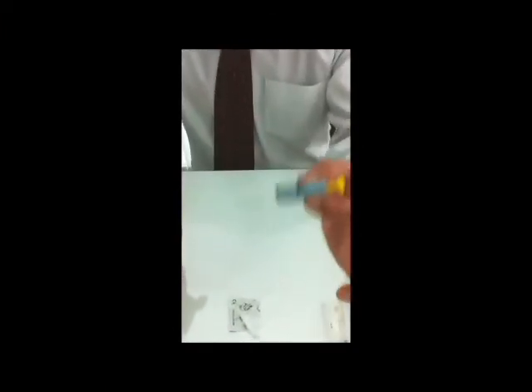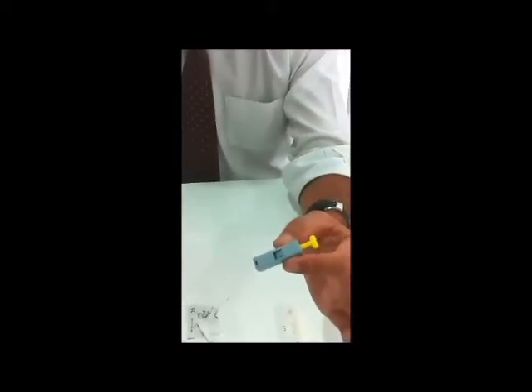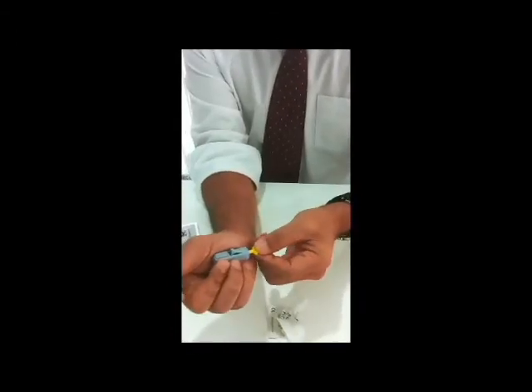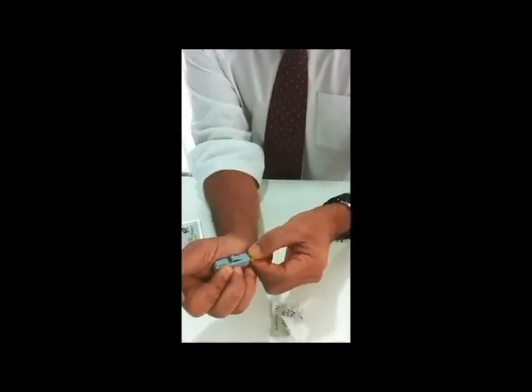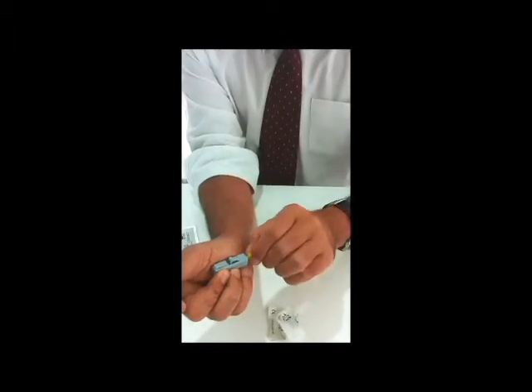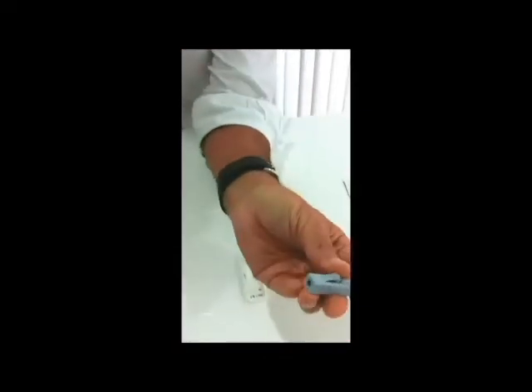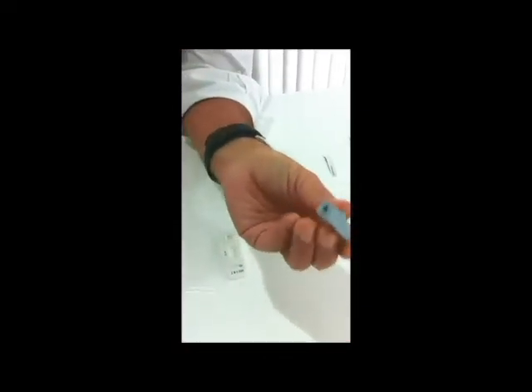You take your lancet — this has a plunger in it, it has a spring, it's like a needle with a spring. You charge it by pushing the yellow lancet in until you hear it click, and then gently pulling it out. From the side you pull the plunger out and you'll see the hole. The hole is where the needle will come out when you click it.